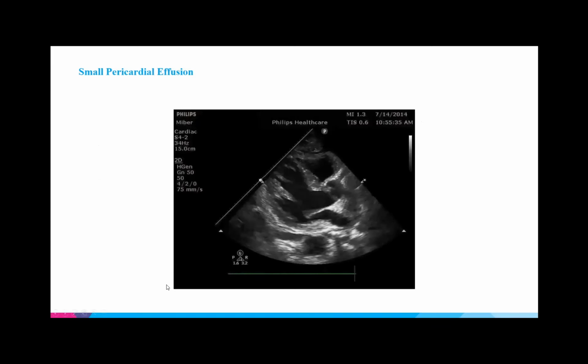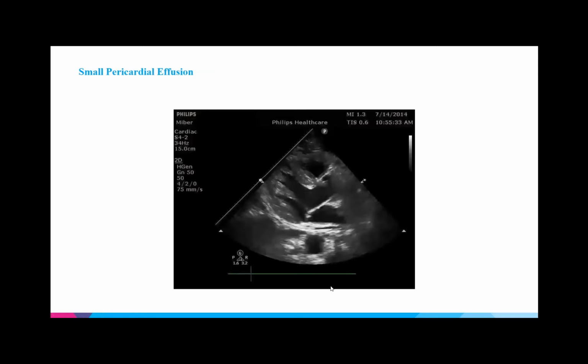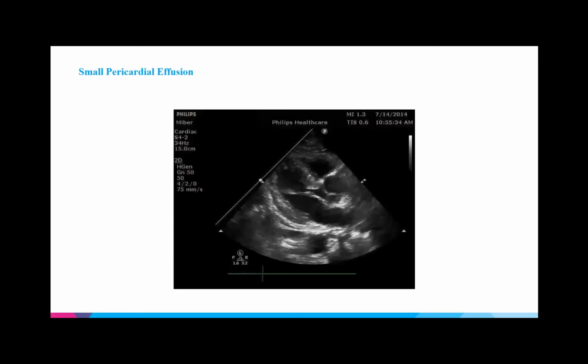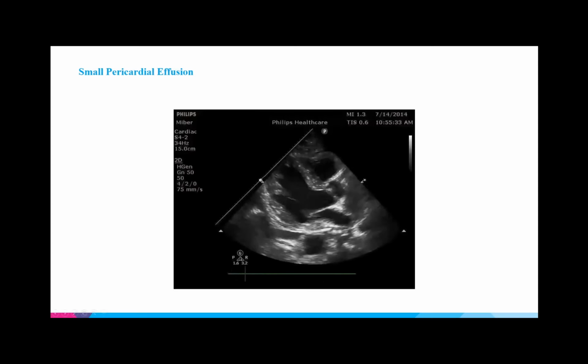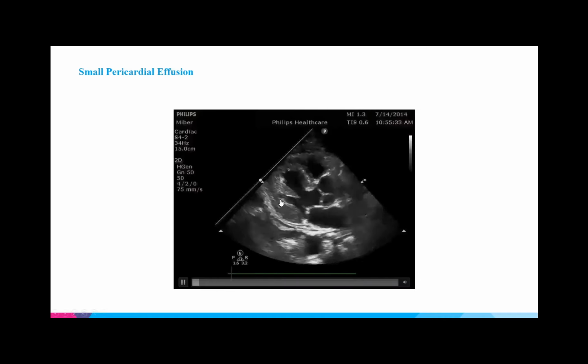Guys, what's the view? You said it last time, I remember. They're saying parasternal long. Perfect. Yep, I agree, it's parasternal long.